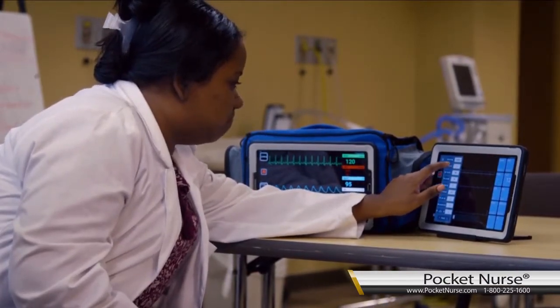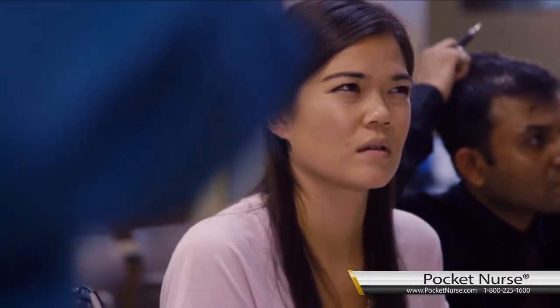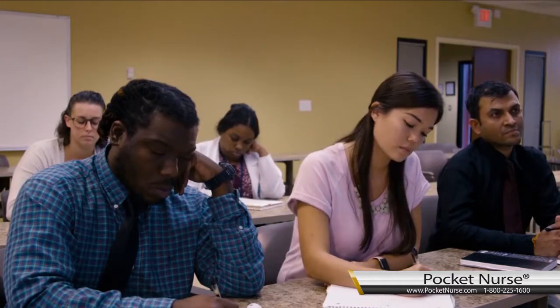Makes you be able to think critically in a real life situation. I feel like when I first entered the ICU, I was really nervous. And when I started to use the system, I felt more comfortable using the ventilator. I think it would be a good system to use for students who are trying to make a bridge into the medical field, just to be able to get comfortable with the ventilator and use those settings.